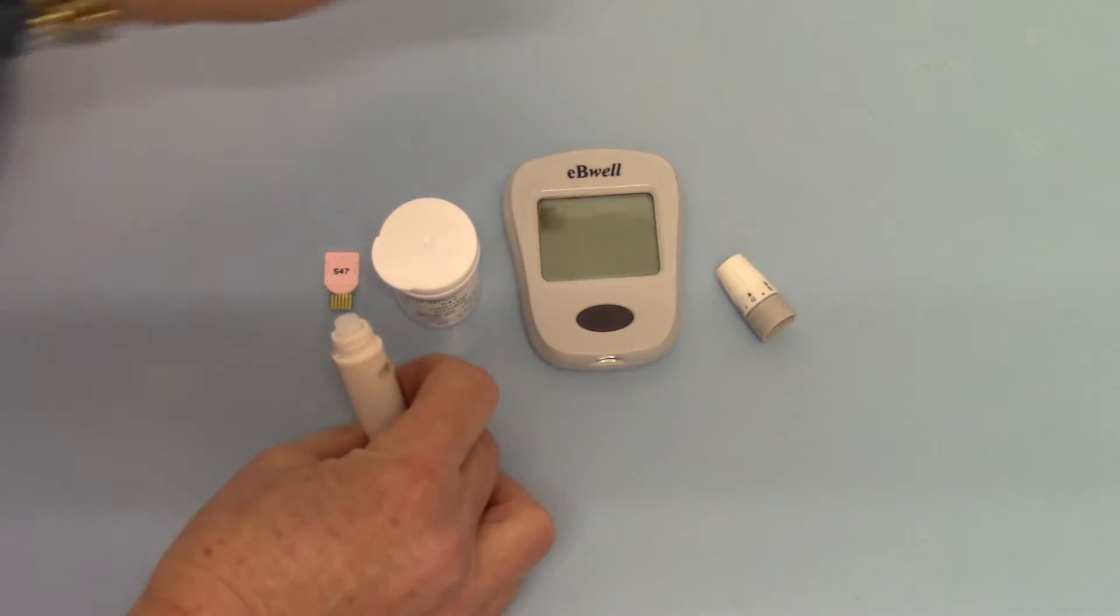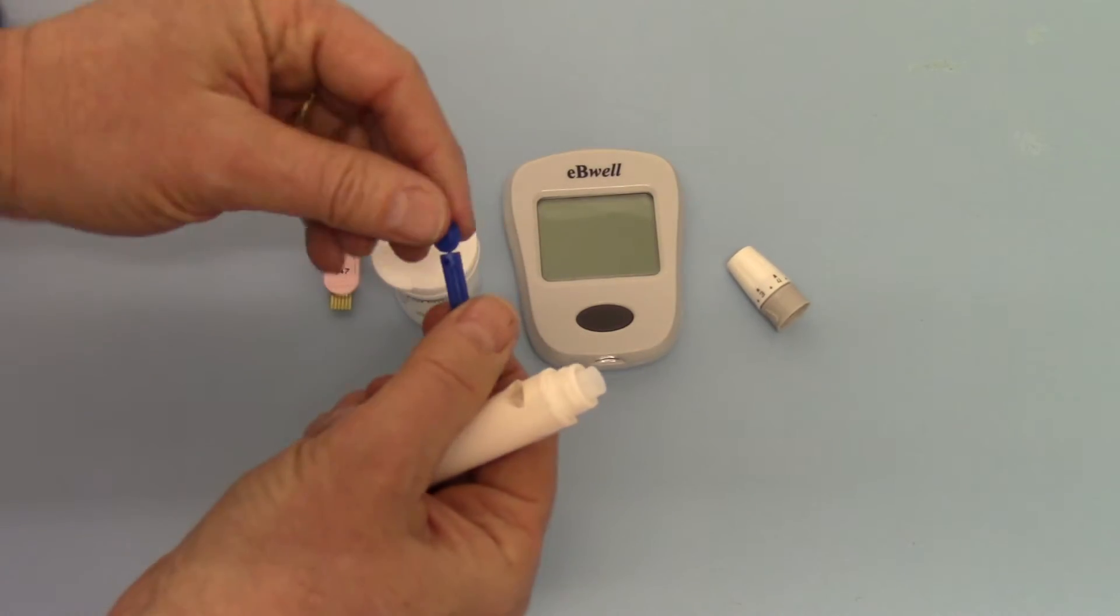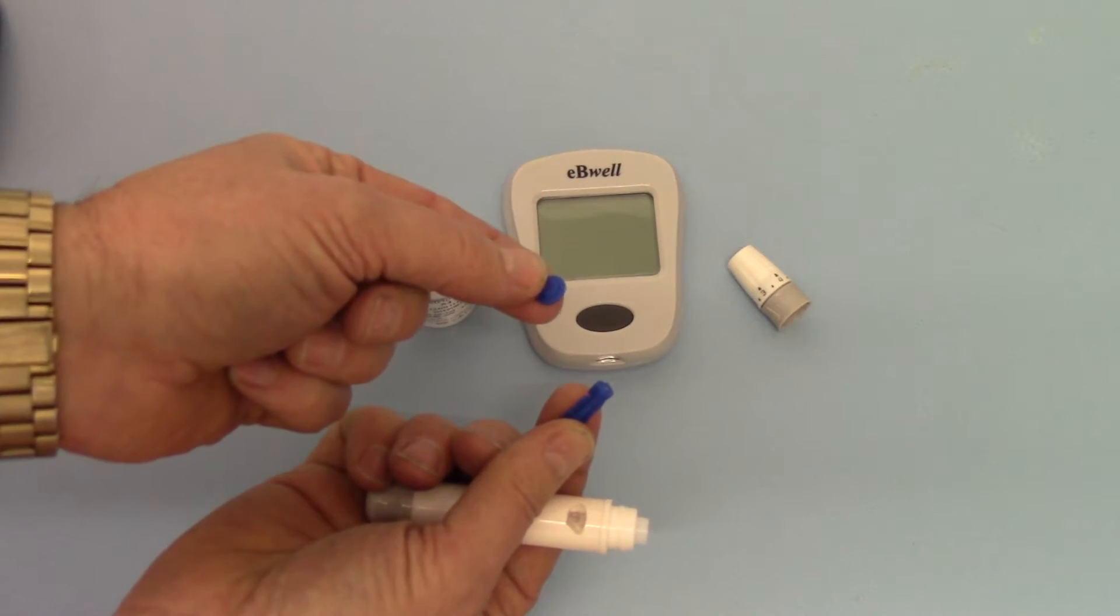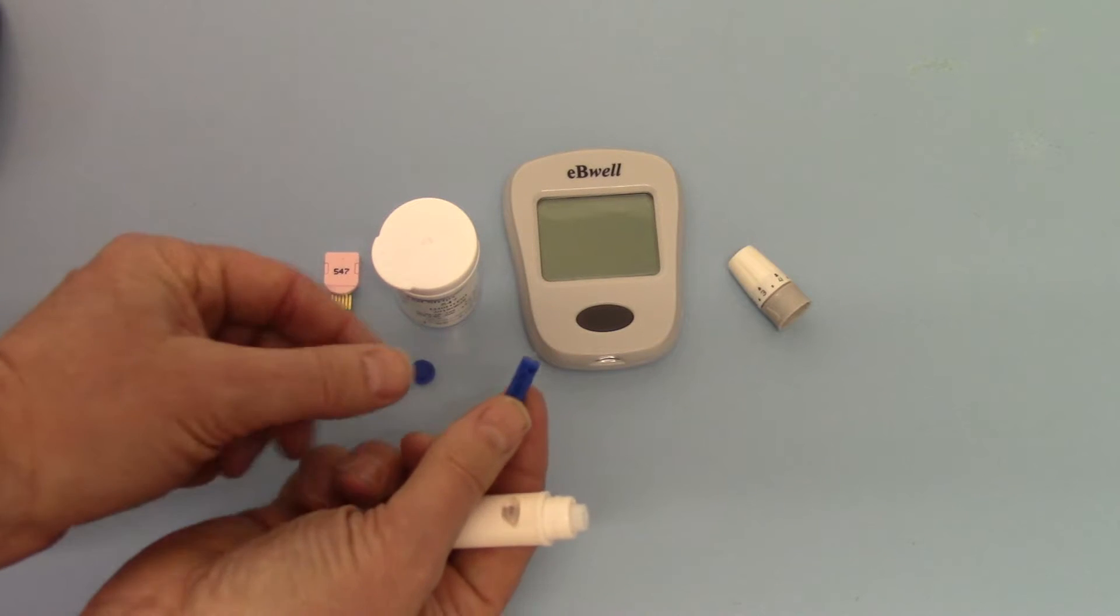So this is one of the lancets. To get it ready for testing you just twist it round and remove the plastic cover.